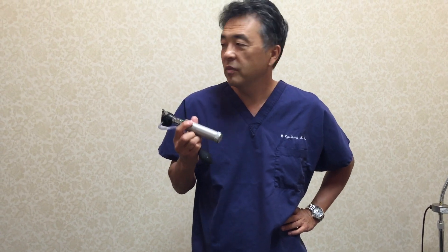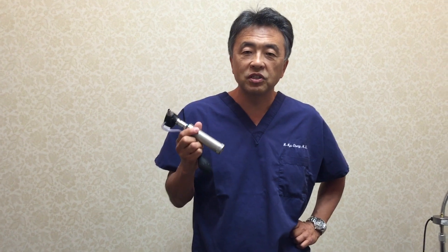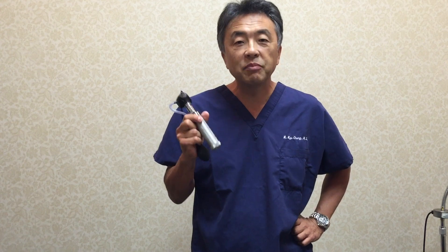My name is Dr. Chung and I'd like to demonstrate a few tricks with the otoscope. I find that a lot of medical students and even physicians, in my opinion, don't use this scope optimally. So I want to show you some tricks.